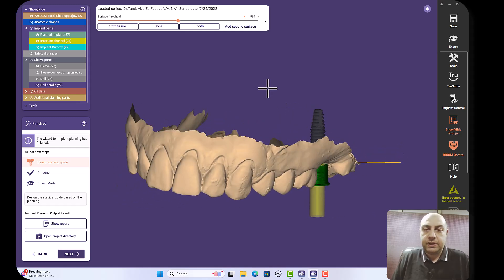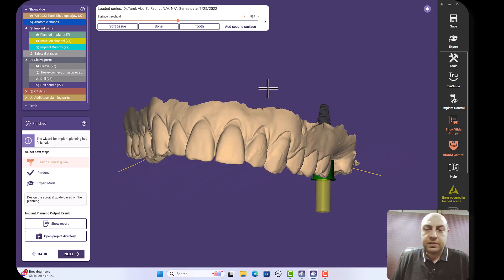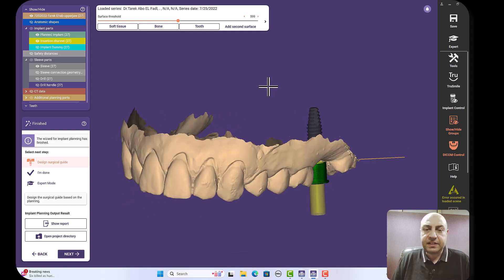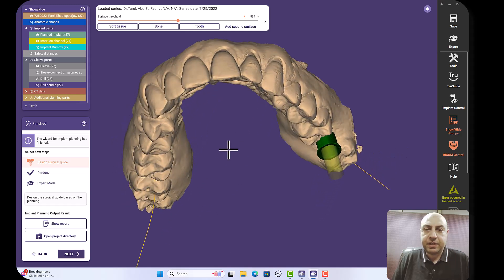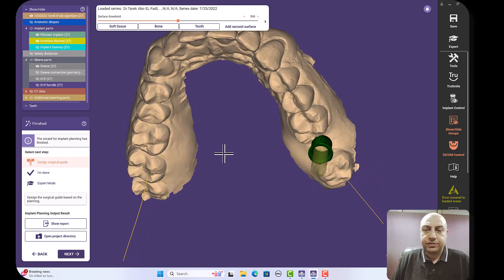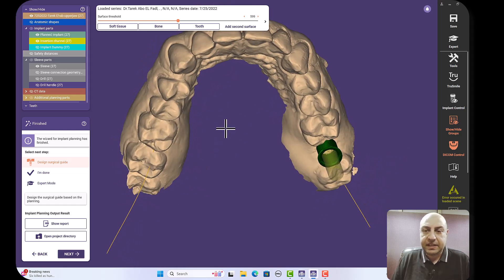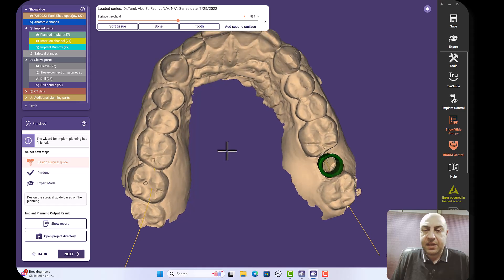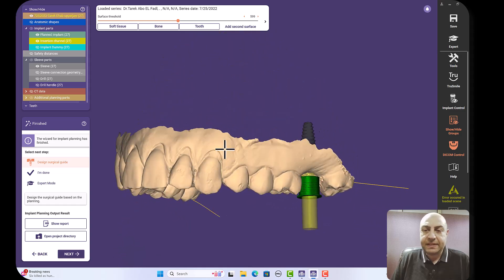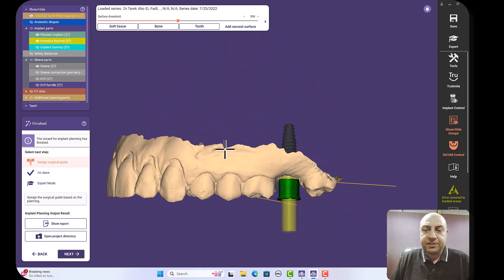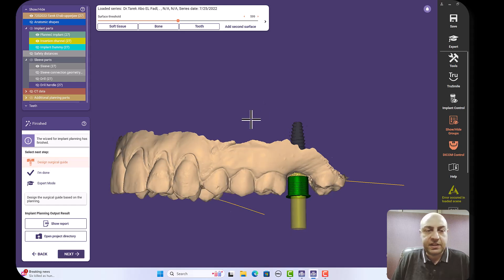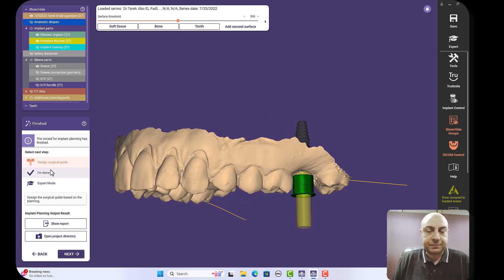So let's start. Now I have my case, it's the case I started at the very beginning of the single maxillary implant. I have my case and the implant is planned, everything is okay, sleeve adjusted and I'm now going either to design a guide or I'm done.